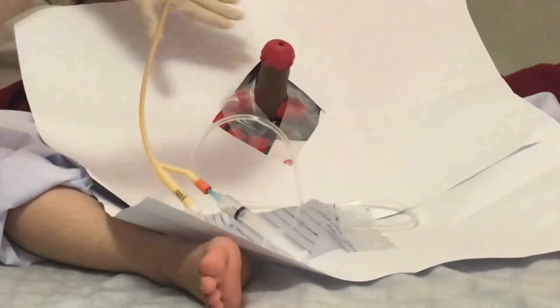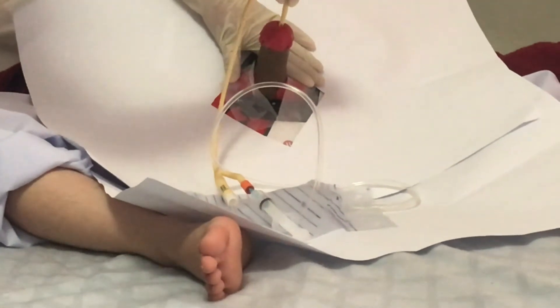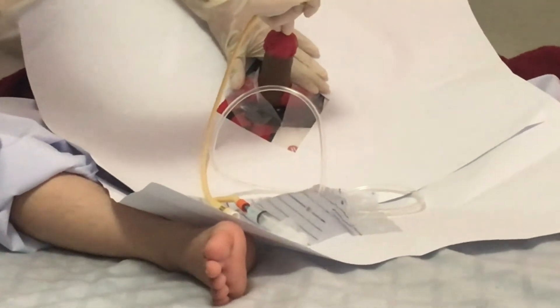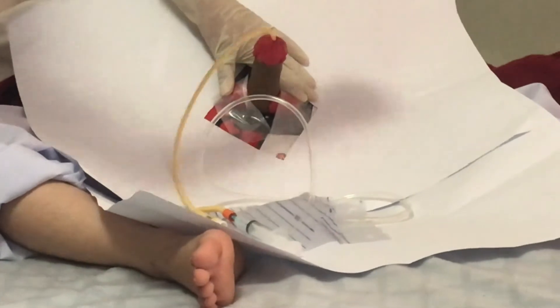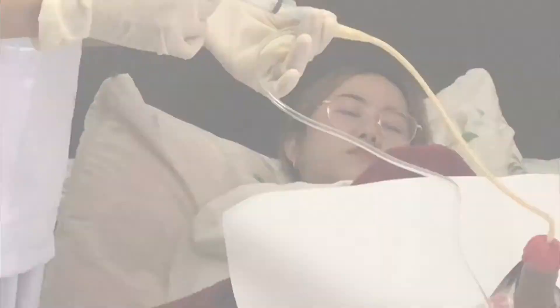Okay mister, can you inhale deeply? And 3, 2, 1. With the dominant hand, slowly insert the catheter through the meatus until urine drains.